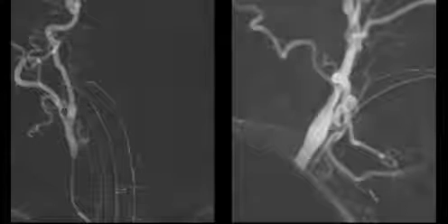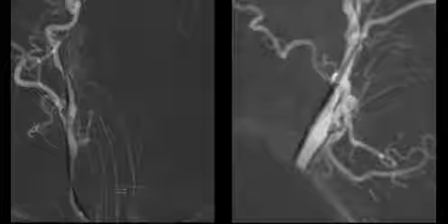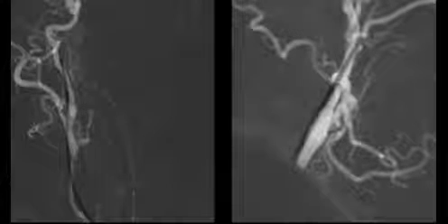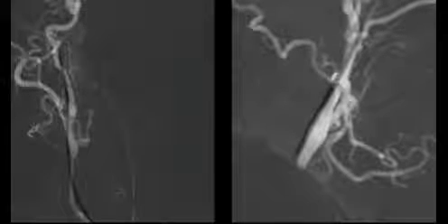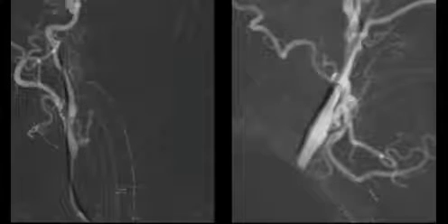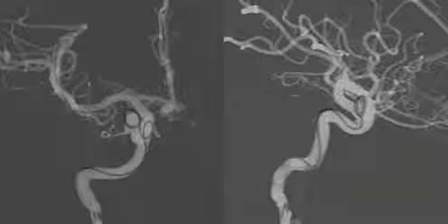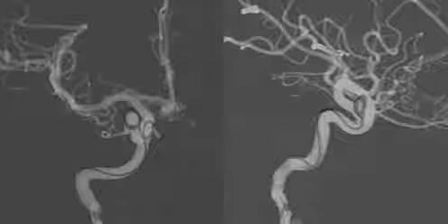Once we've decided to treat an aneurysm, we have to get a larger catheter or tube up into the neck of the patient. The computer will actually allow us to make a map, and what we're looking at here are the blood vessels in the neck that are saved as an image and overlaid onto the screen so that we can move our catheters first through the neck and then a much smaller microcatheter over a fine wire up into the aneurysm or past the aneurysm as the need be.